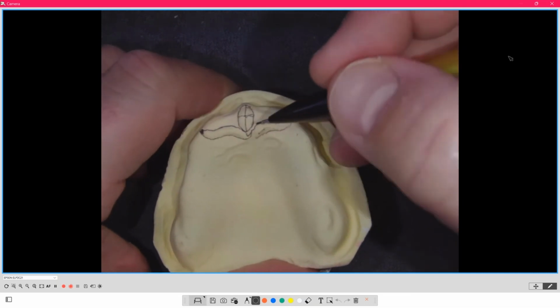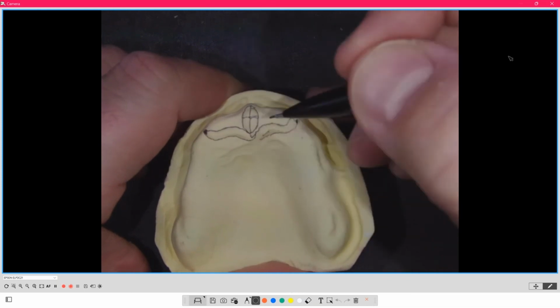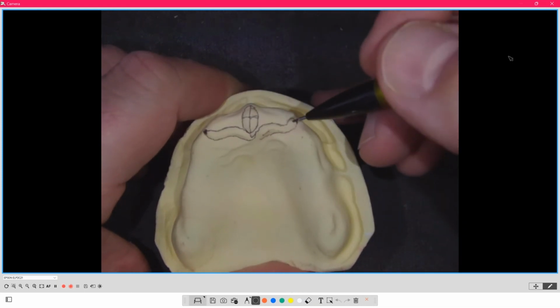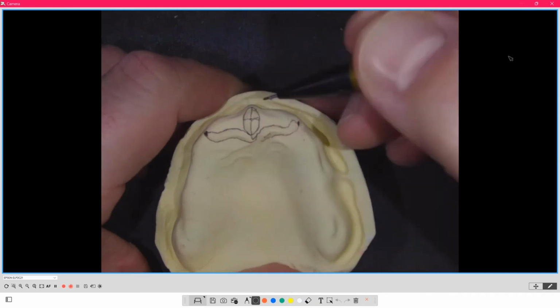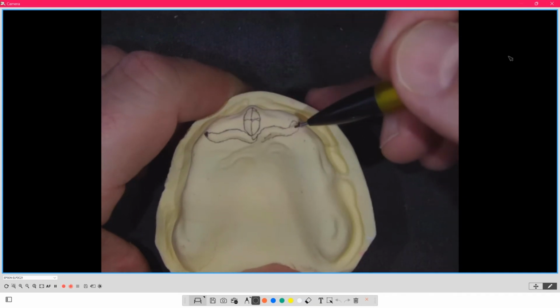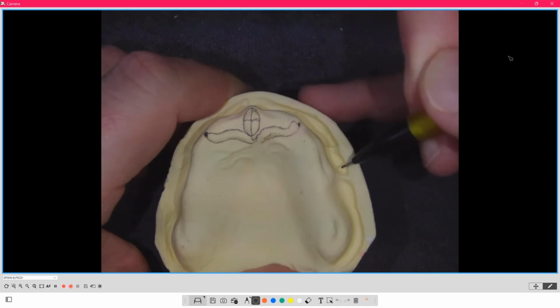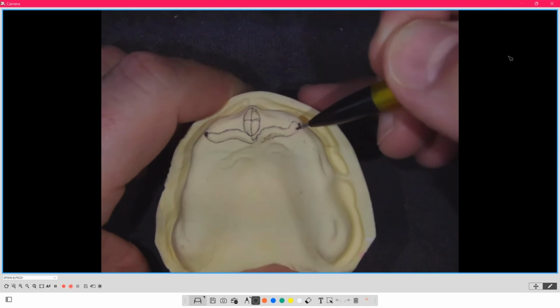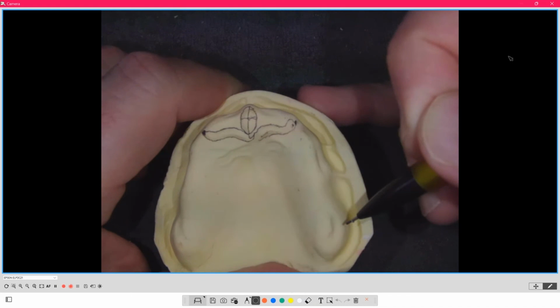So they're there. If you leave the denture out, then it allows this to hydrate before you take the impression, because then you're not taking the impression on squished gum. So it allows it to rehydrate, and then they show up better. So you're actually setting the teeth in the lab and they're coming across, and you're setting the cuspid in reference to this. This is really important because then the other teeth will fall into place through here.